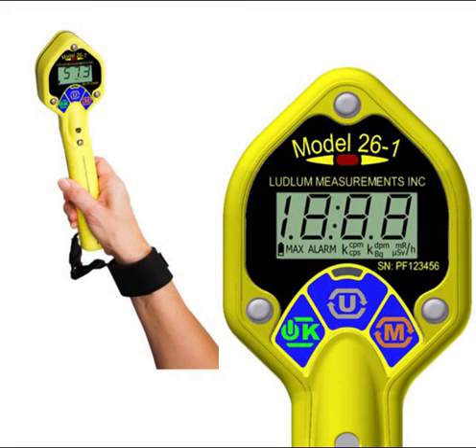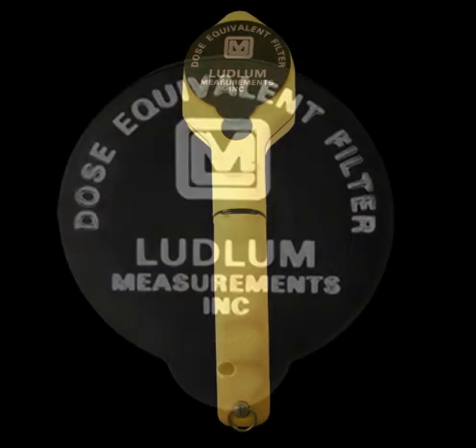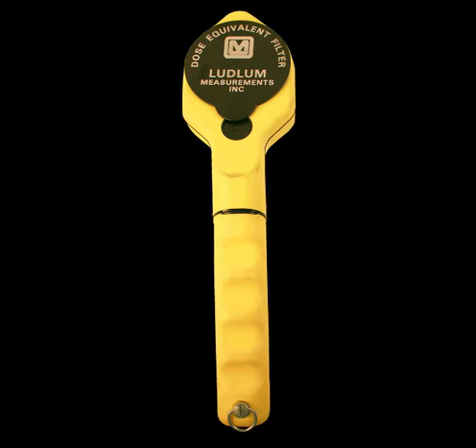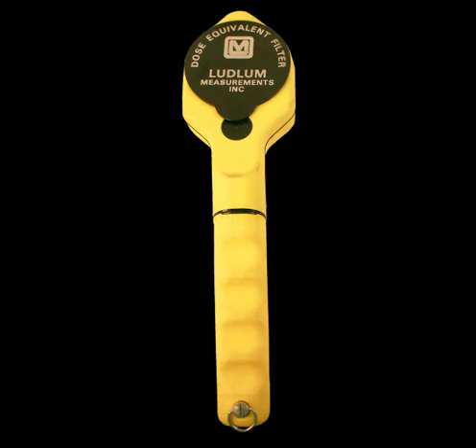That concludes the basic use and operation of the Model 26-1 Frisker. Before we go, we want to mention some optional items. One option is a device called a dose filter, which replaces the normal protective cap and snaps in place on top of the detector screen, acting as an energy compensation filter. Because the pancake tube over-responds to low energy gamma radiation — shown as the red line on the graph — the dose filter produces a much more accurate response, as shown by the green line. Note that the Model 26-1 cannot detect alpha or beta radiation while the filter is in place.